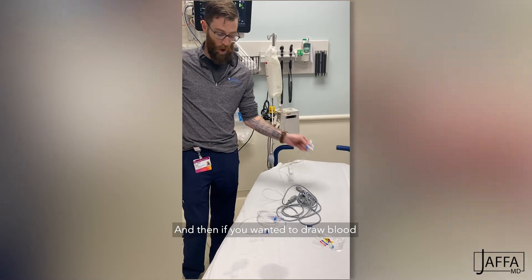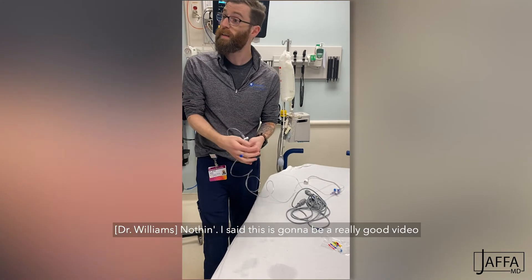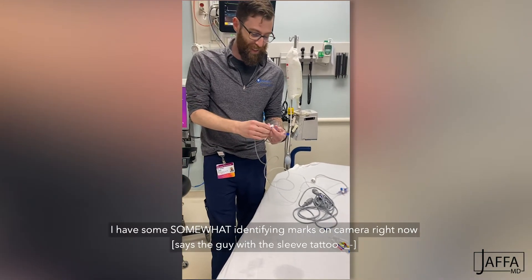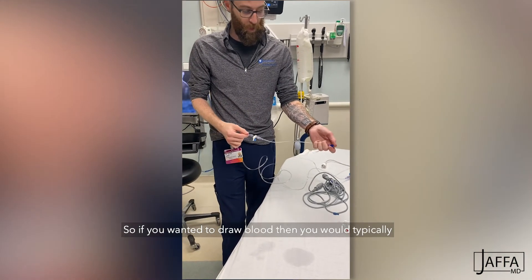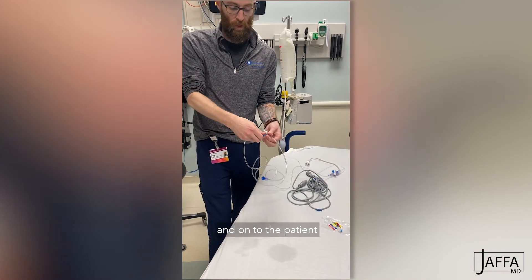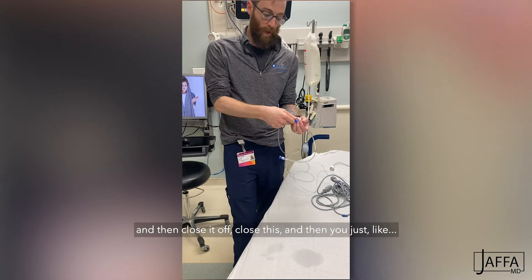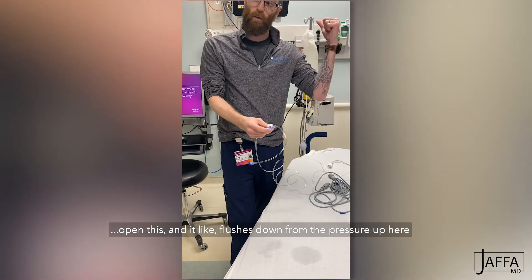If you wanted to draw blood, you can turn this side if you've got this part connected. This would be connected to the patient, so you turn this off to the system and onto the patient. You open the side port and draw out a waste amount, then draw the actual arterial gas, and then close it off. Then you just open this and it flushes down from the pressure bag, opening that pressure into the patient.